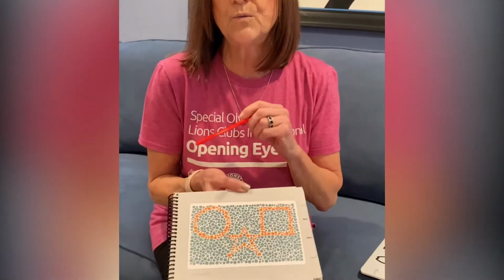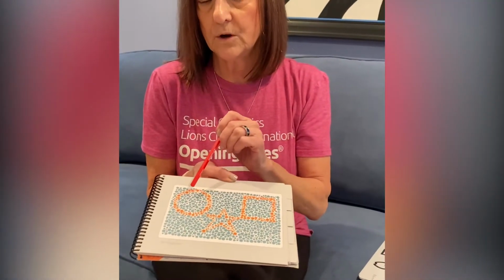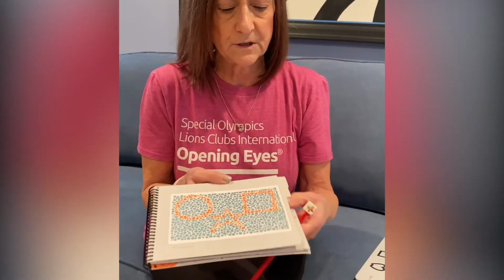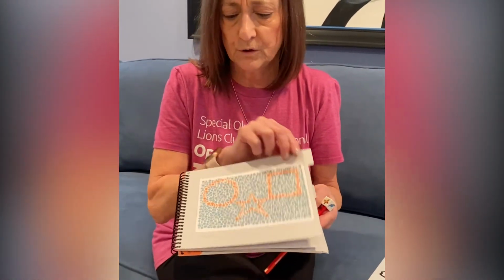And the way we work it is we ask the athlete to point to the circle. If they understand the concept of circle, we're ready to move on. If we need to, we'll give them a Q-tip to point to it. We don't want them touching the card because oftentimes in the events that we go to, the athlete's hands are dirty or full of oil. So we typically will use a pointer, which is either a stick that they might have or a Q-tip. And sometimes they'll trace it, which is absolutely perfect. Whatever works best for the athlete is all we're looking for.